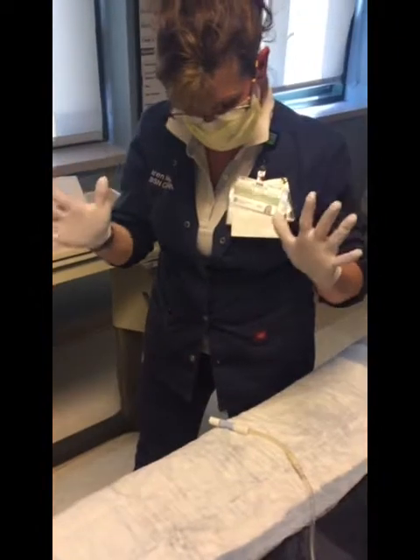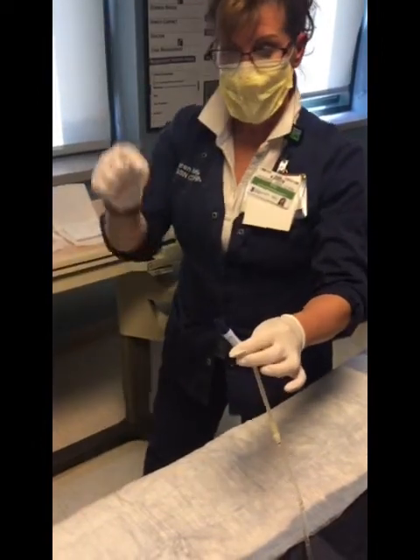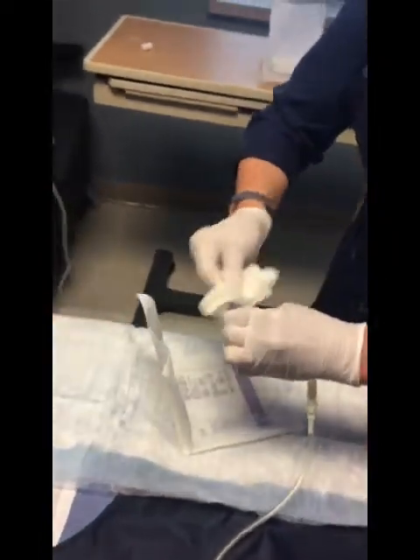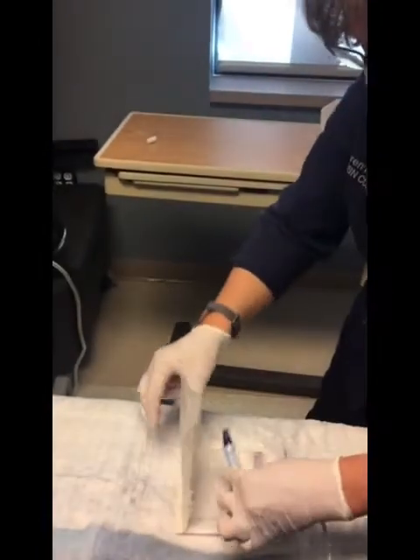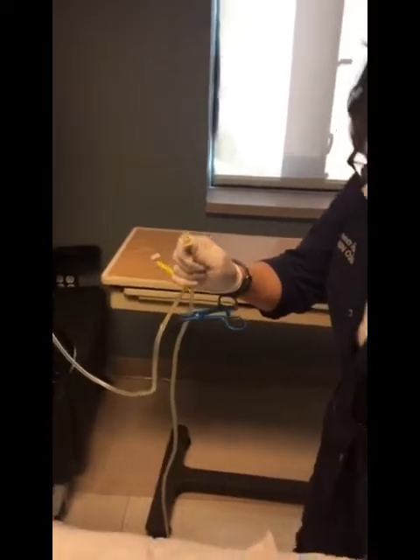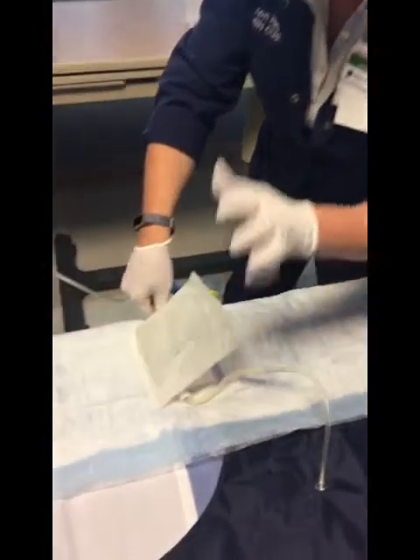When you're all set, hands are clean — it's aseptic. You take your container and remove that. That end is the only piece that is sterile; that's the piece you have to worry about. Take your gauze, clean it, and let it set until you're ready. You're going to pull this off and discard it, take your piece out, connect it, and then remember to untwist it here — it has a dual cap. This can then set back on your field.